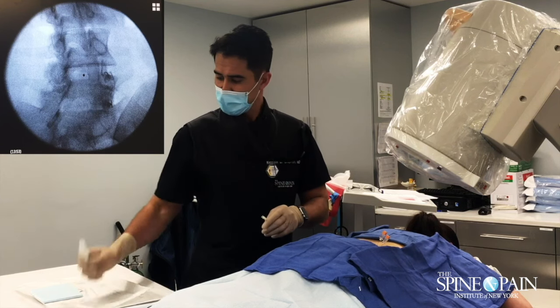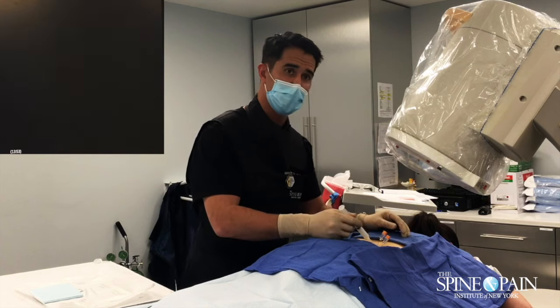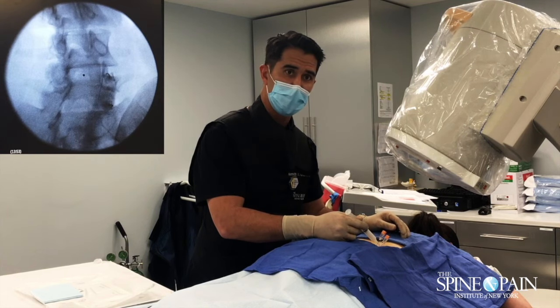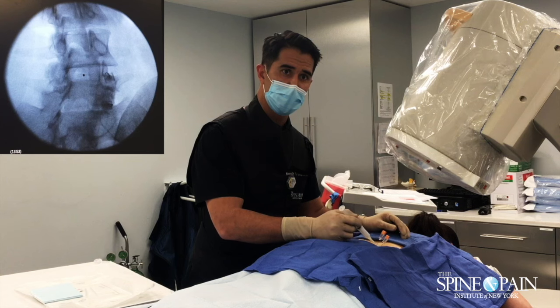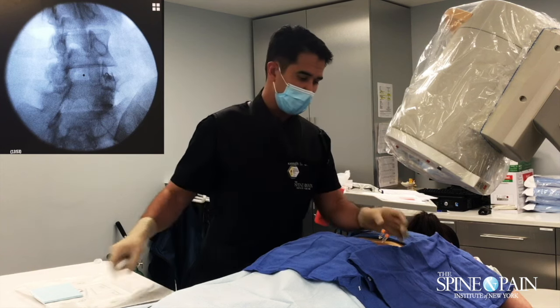If you look right here, you can see the joint pretty clearly — looking at my needle on the screen there. That line going down is the facet joint. You can see this one isn't so clear; it's kind of darker, which is going to indicate some damage down at that level.